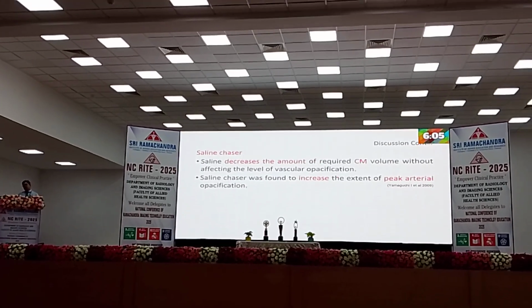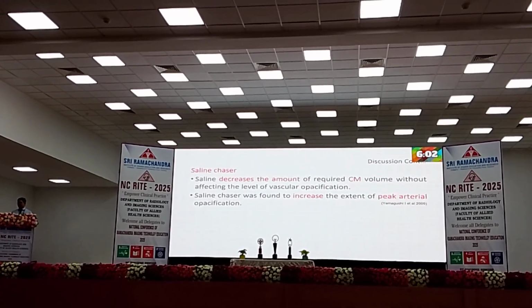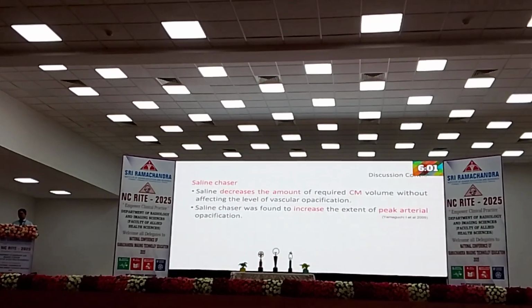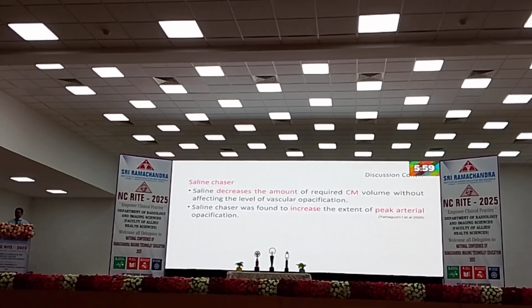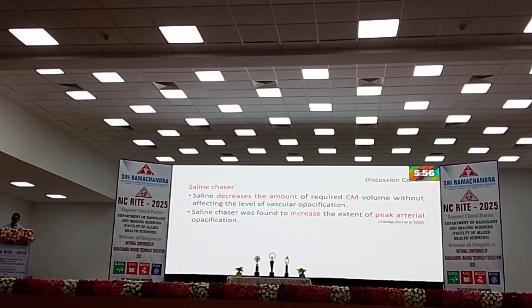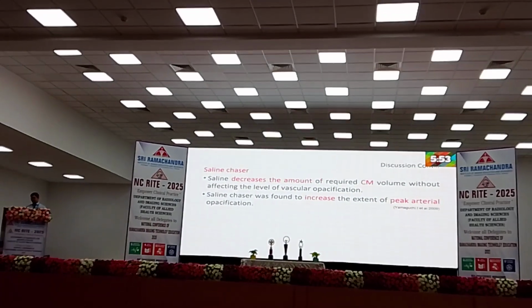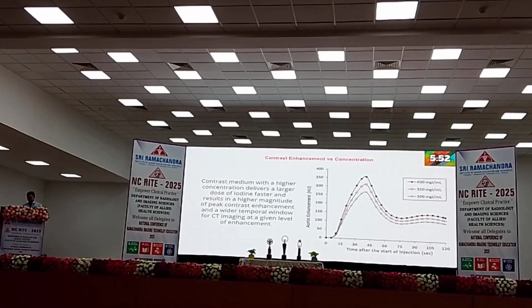The second one, you will have the flow rate constant at the end of the contrast injected to the patient, or at the completion of the scan, you are able to get the flow rate constant. That is the benefit when you are using a saline chaser.